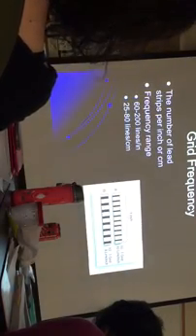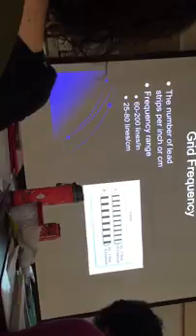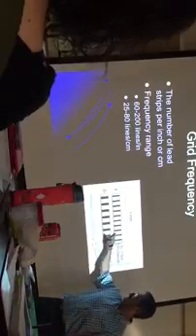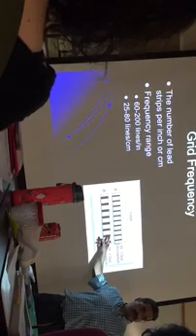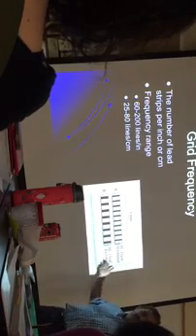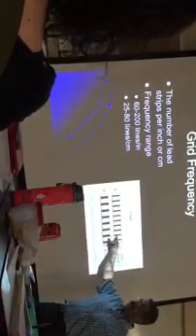What is it? You tell me. How do you get grid ratio? Height of the lead strips H over D, the interspace width. If you change this, that's going to change your ratio, or if you change the height. In this case, they're both 10:1. But in this case, they made the lines thinner.